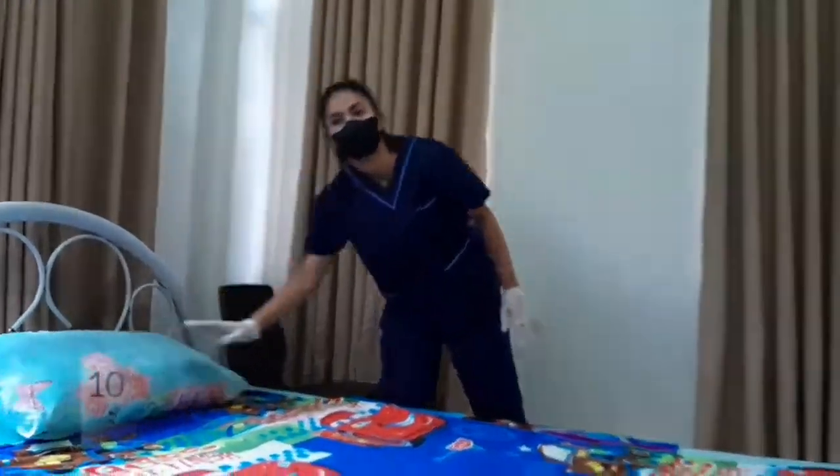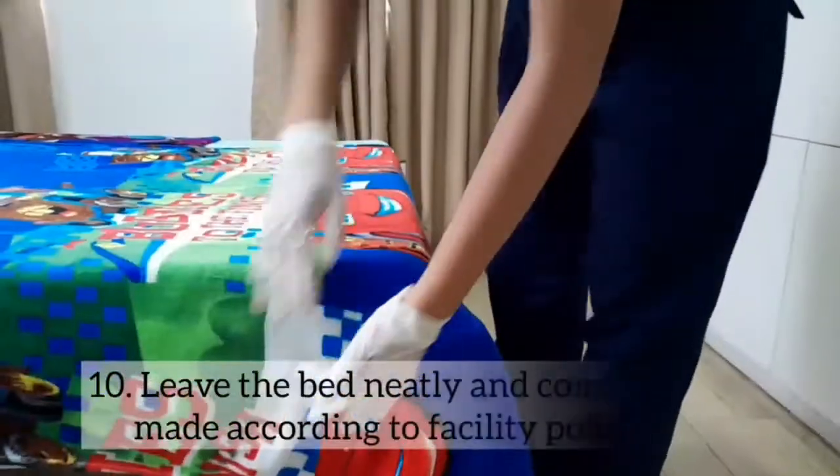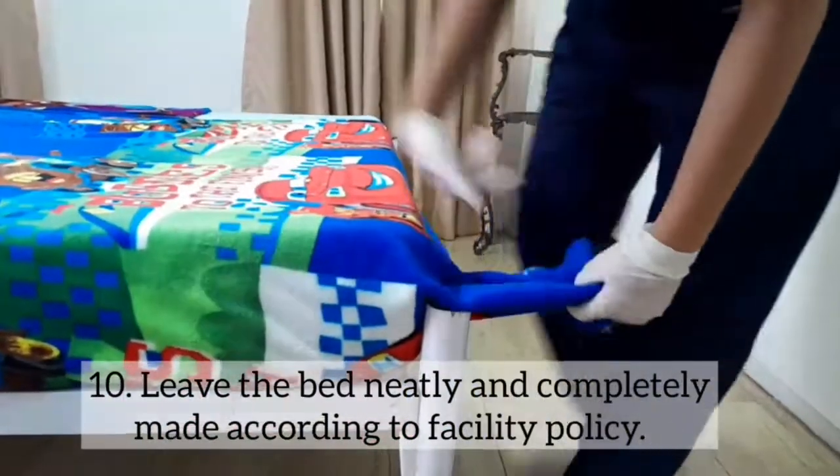Step 10: Leave the bed completely and neatly made according to facility policy.